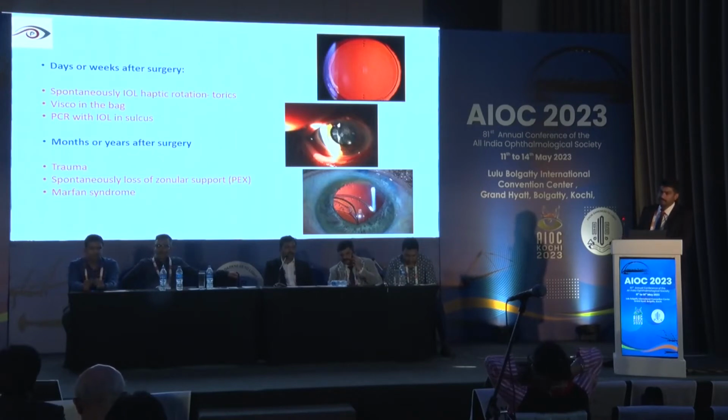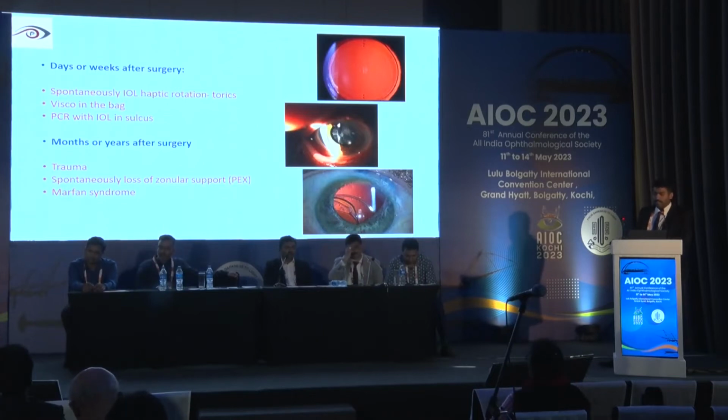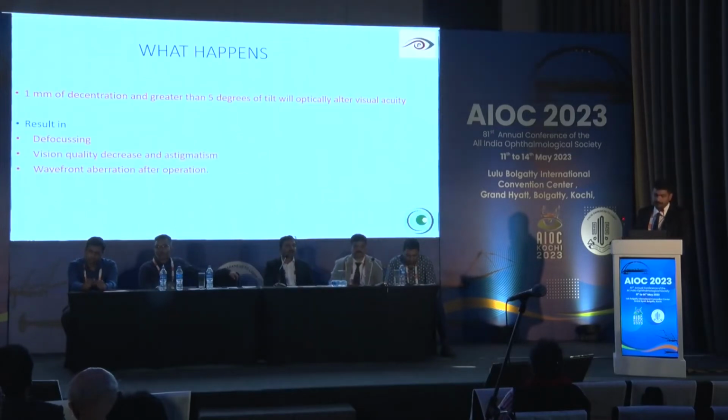And if there is a distension of the bag, it could have caused a tilt of the IOL, that is an anterior-posterior tilt, because as little as 5 degrees of tilt can cause some amount of blurring. And then there could be secondary causes, which could be patient-based, which can happen way later than the few weeks or days that I was describing.